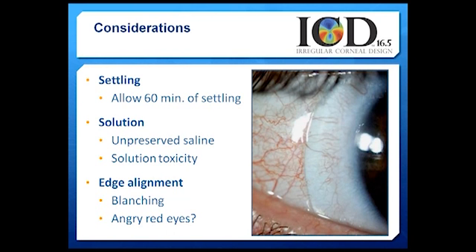It's also important to understand that sealed scleral lenses that land at 14, 15, 16 millimeters or more often trap the fluid between the lens and the eye. As that lens sinks into the boggy conj, it's going to trap that preservative-free fluid there. Over time, for a small percentage of patients, that fluid will become milky.